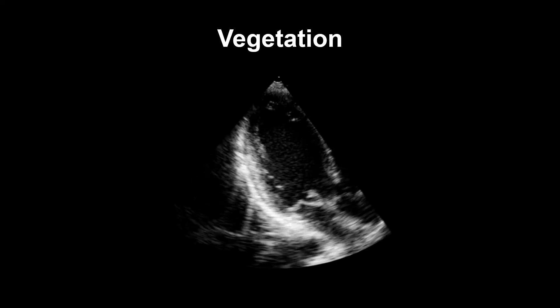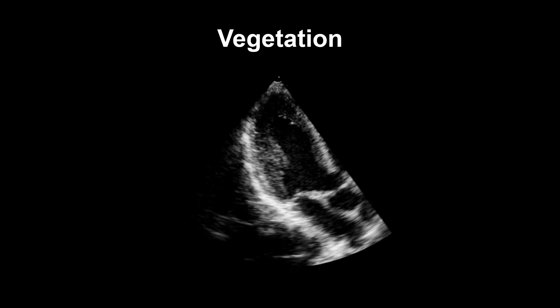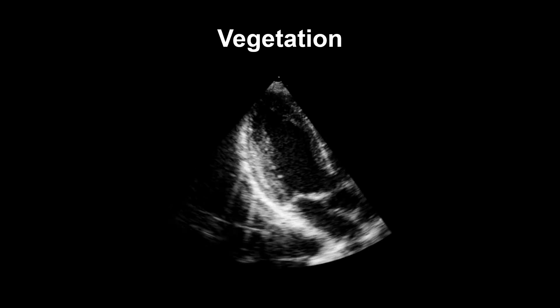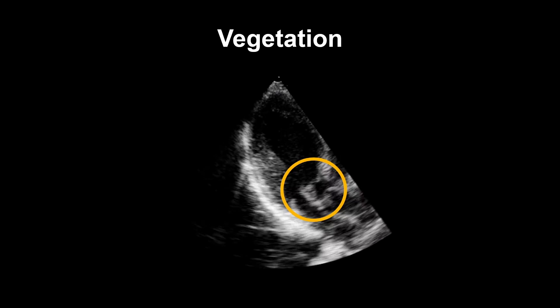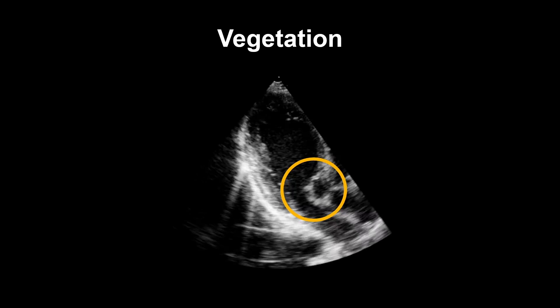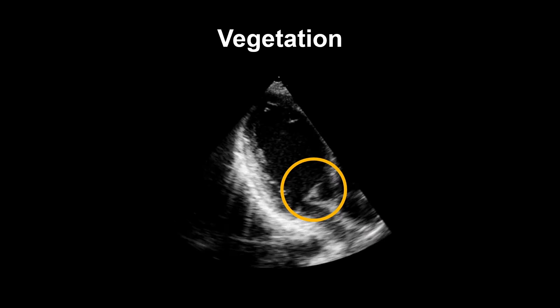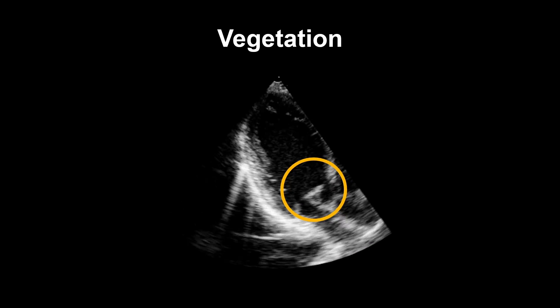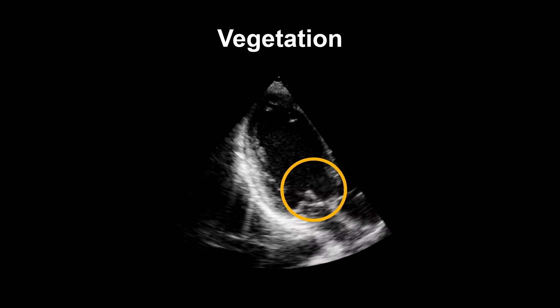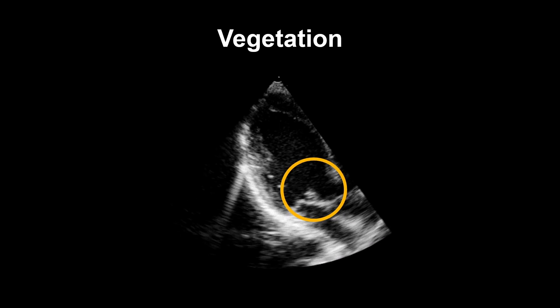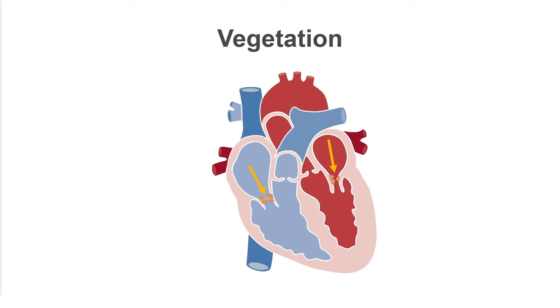A vegetation appears on echocardiography as an oscillating intracardiac mass on a valve or its supporting structures, in the path of regurgitant jets or on implanted material. Typically, valvular vegetations are found on the atrial side of the mitral or tricuspid valves, or the ventricular side of the aortic or pulmonary valves, though this is not an absolute rule.